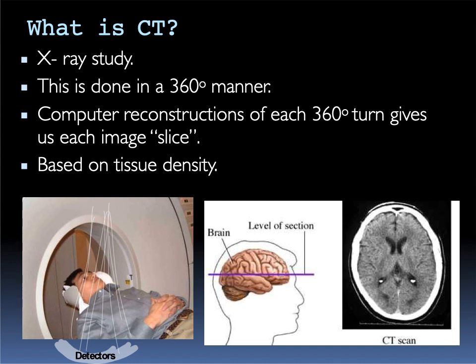Actually, the CT is an X-ray study, and it can rotate and give you a picture in a 360-degree manner, and it can reconstruct the imaging.